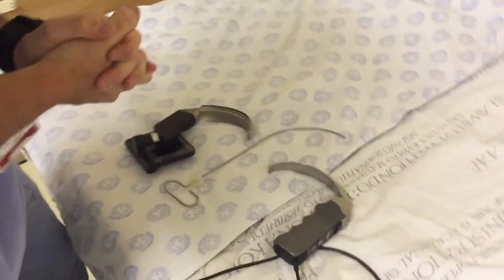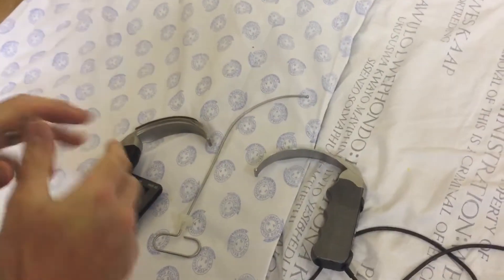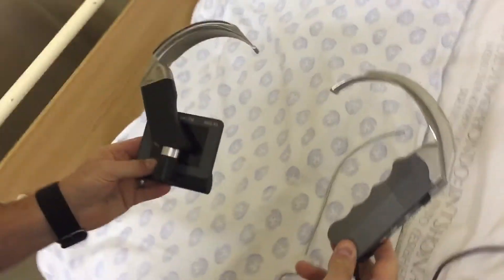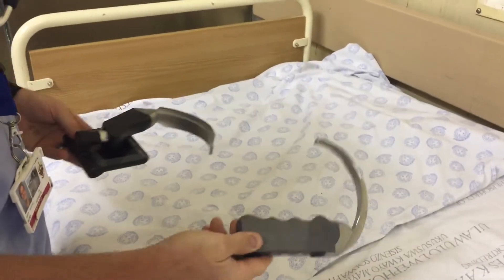Look, we've got some dirty C-Macs. I think we better clean them. So how are we going to clean these? Well, it's important to notice we've actually got two different kinds of C-Mac here.